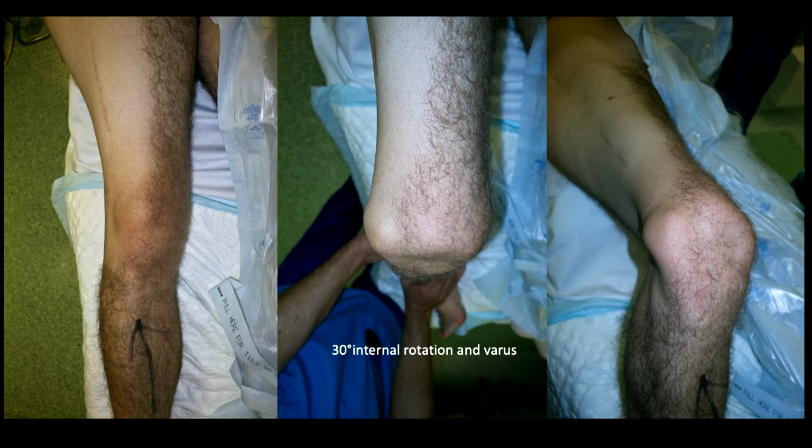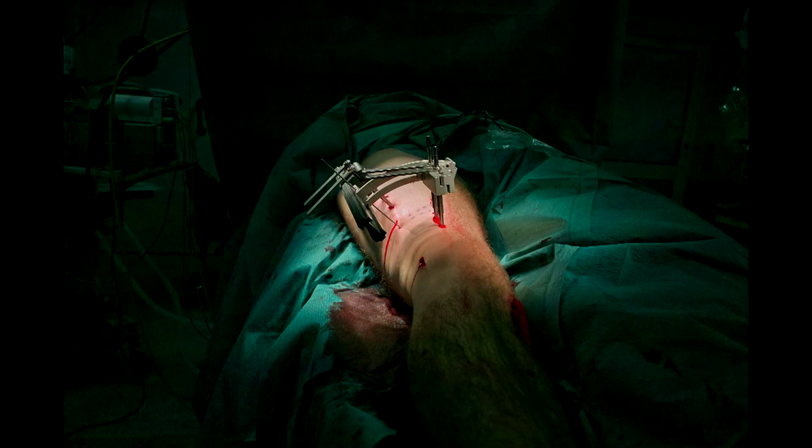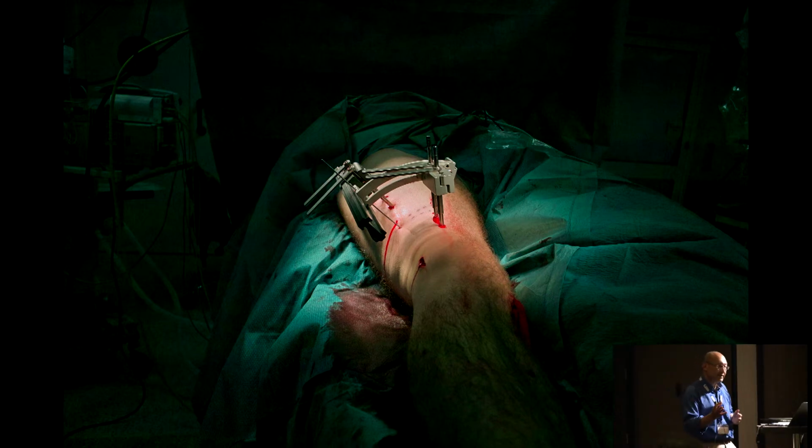No. How do we solve this? You start first by using derotation templates. That's one of the qualities of the rail system that you need to have. And having derotation arcs, you can dial in precisely the amount of derotation you want. And here we've dialed in 35 degrees of derotation. Notice that I'm placing the rail anteriorly. This rail is in the anterior position of the femur. I perform the osteotomy based on my preoperative planning as to where I want to achieve the correction of the angulation and derotation.